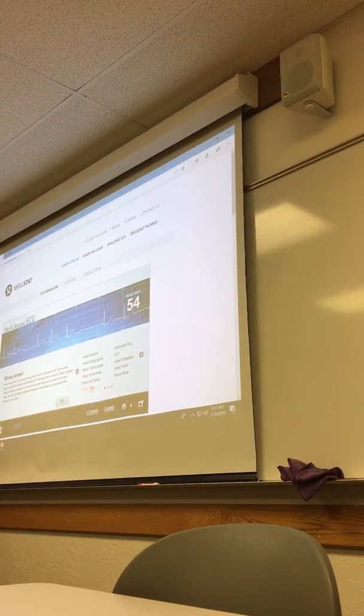Who has questions right now? Yeah, but look at how long that is between the two. Between the blocks. So the exit block just has longer pauses.